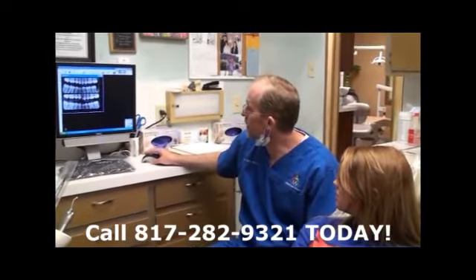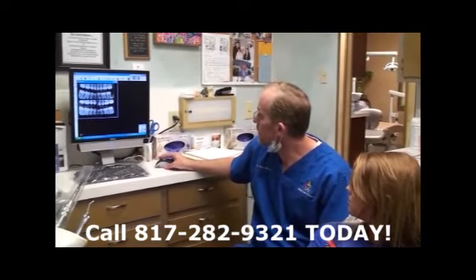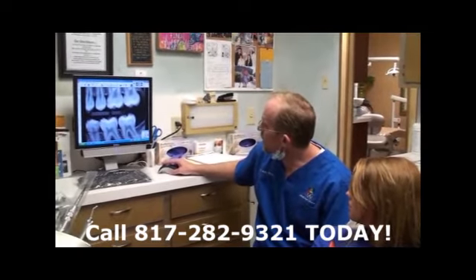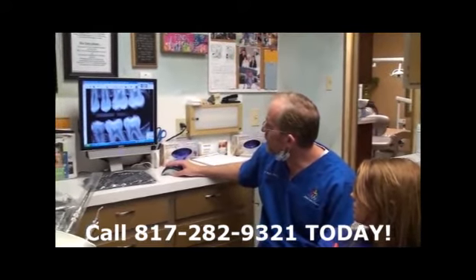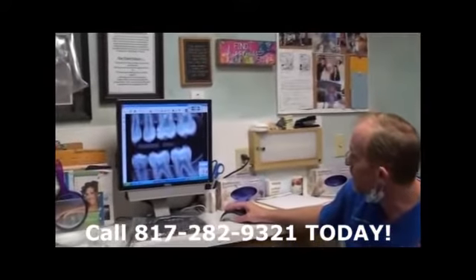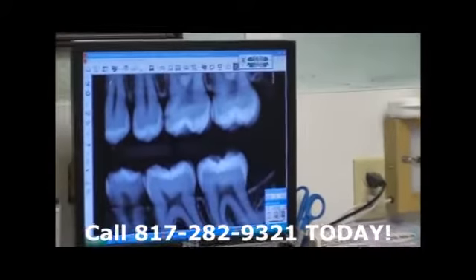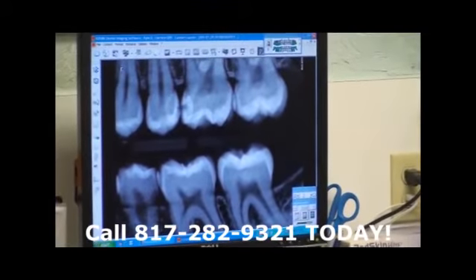This is your upper left area. Pull this out here. There we go. And what we look at is little shadowings like this. This is a shadow, and I can even do this right here and it will highlight that spot for me. I can also change the contrast to lighter or darker, and you can see that area a little more clearly on the x-ray.